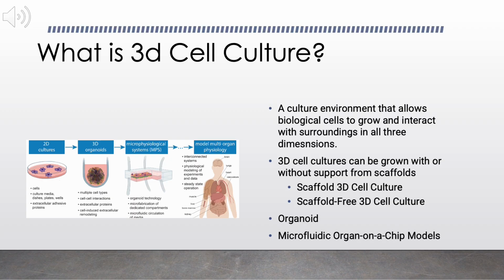Let's get into what 3D cell culture is. 3D cell culture is an environment that allows for cells to grow and interact with the surroundings in all three dimensions. The main reason for using 3D cell culture for growth is simply because it's a way better way to represent human tissue outside the body. 3D cell culturing became of severe importance in the 1980s when Mina Bissell, a researcher, proposed the importance of tissue microenvironment and 3D culturing technique for cancer research.